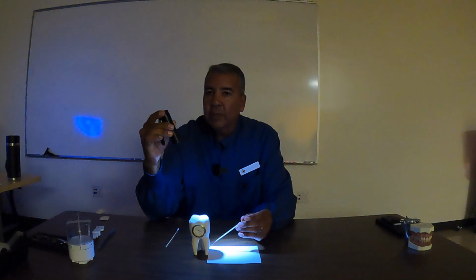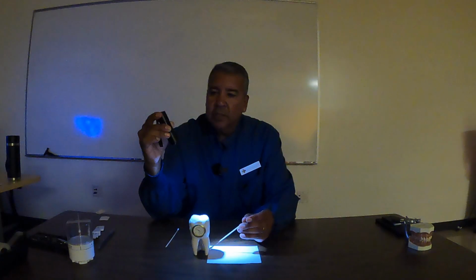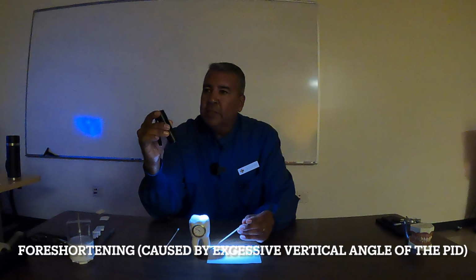It is foreshortened. So this is the error that we have in your textbooks, and you'll want to know what this is. So any position of the PID that is more than the bisector will result in foreshortening. More than the bisector will be foreshortened.